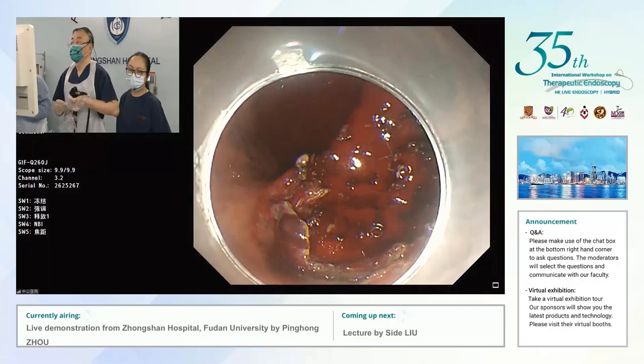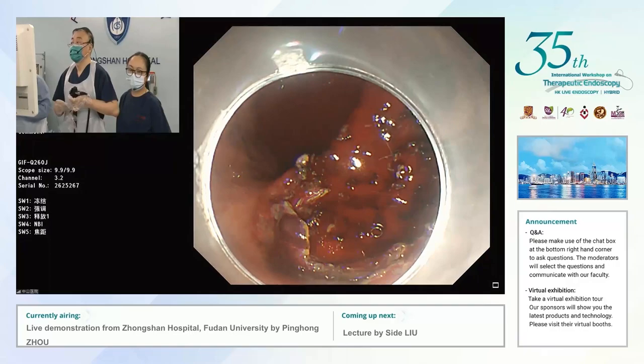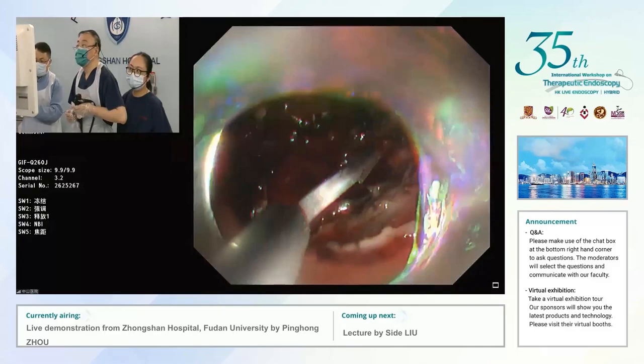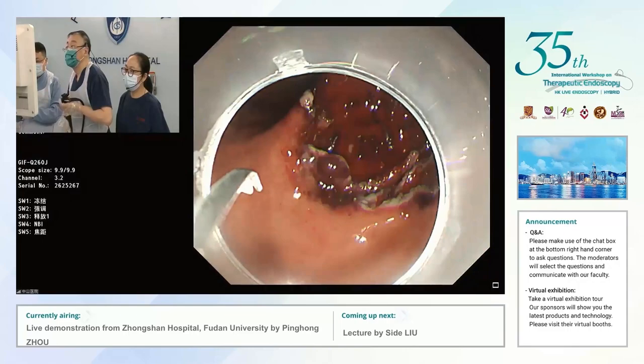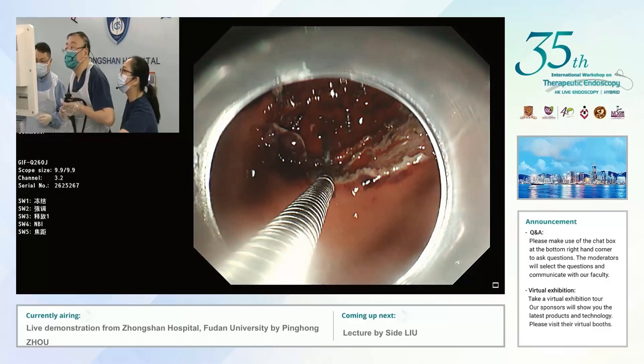James, with this bleeding from these big vessels, what is your experience using the Ovesco for control? It's very good. Any benefit over traditional clips? We just completed an RCT. Recurrent bleeding with very large ulcers has been only around 3% — about three in 97 patients.